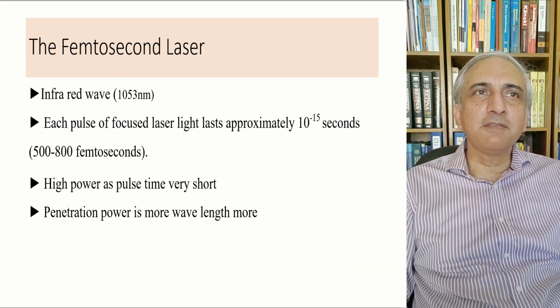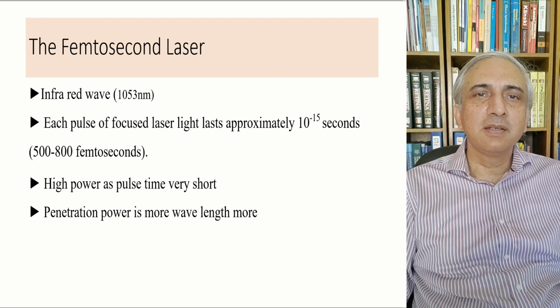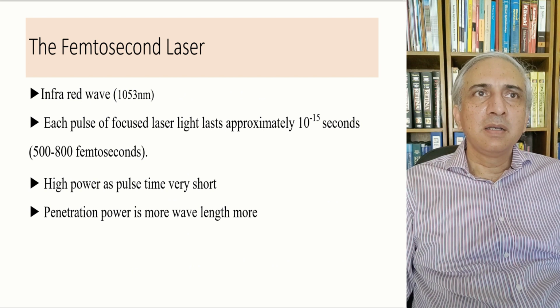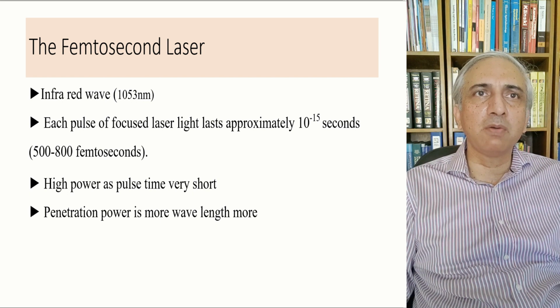On the other hand, the FEMTO laser is an infrared phase laser with 1053 nanometers. Each pulse of focused light lasts approximately 10 to the minus 15 seconds. High power as pulse time is very short. Penetration power is more with longer wavelengths.